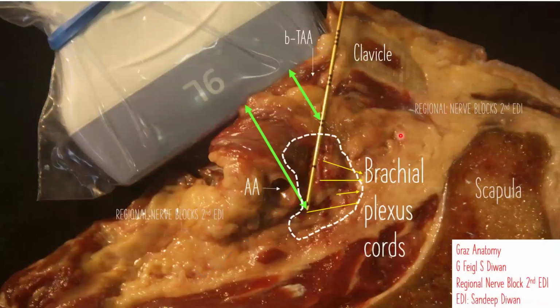Now, when you do an infraclavicular block, you can say that this is a sagittal section. The previous one was an axial. This is the clavicle. This is the axillary artery. This is the brachial plexus elements.